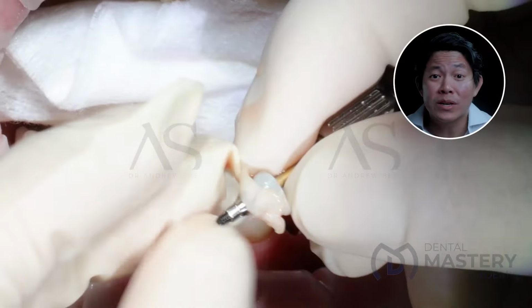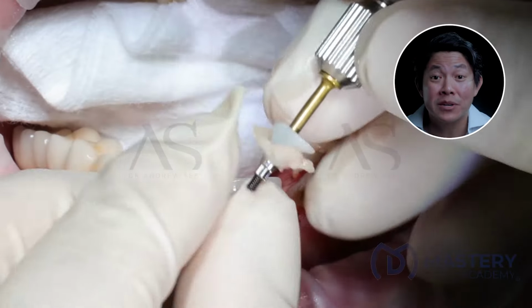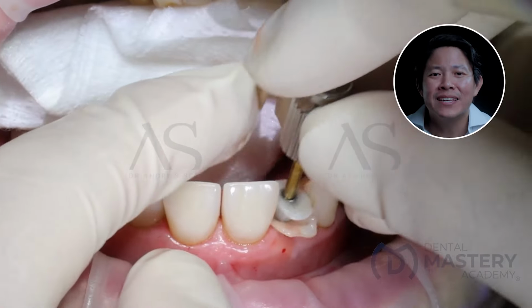You then can make a provisional implant crown, and depending on the primary stability that you achieve, this may need to be modified to a custom healing abutment like I did here.